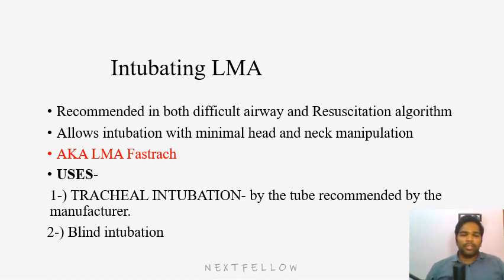It allows intubation with minimal head and neck manipulation, so it is helpful in cervical injuries. You don't need to extend the head, you don't need to flex the head, so you can easily intubate the patient. It is used for tracheal intubation, blind intubation.